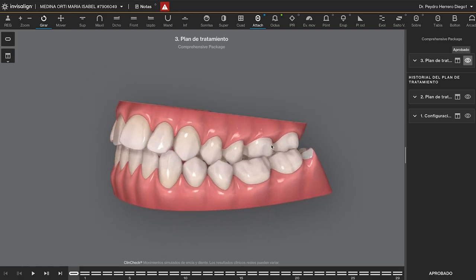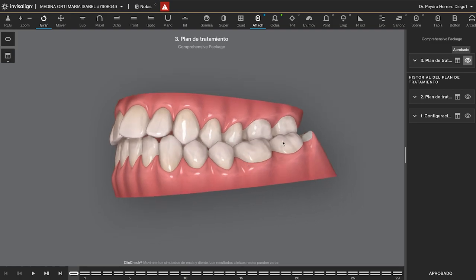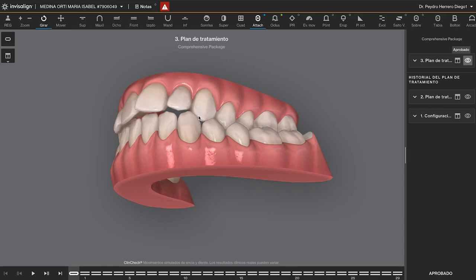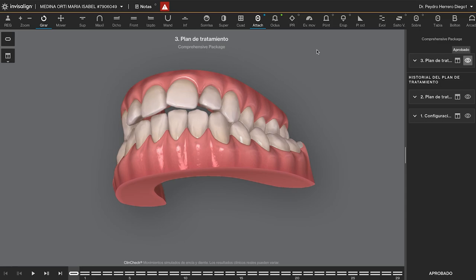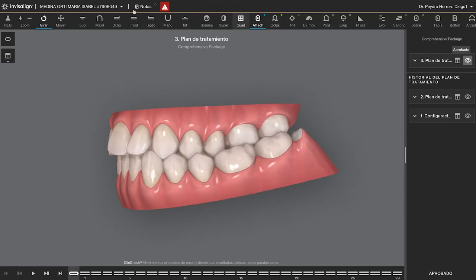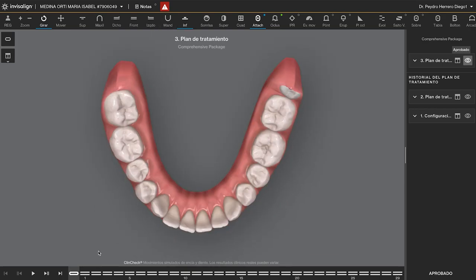But on the left, the crossbite is involving all the second molar, first molar, premolars, and also almost crossbite with the 13, where I have this interference. In the lower arch, we have minimum crowding.